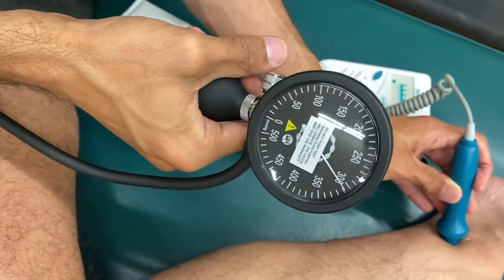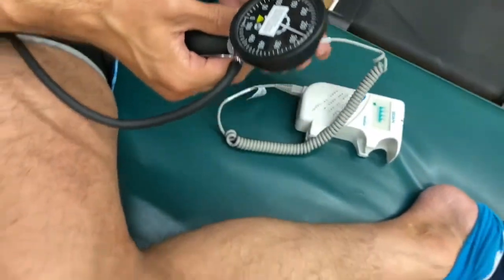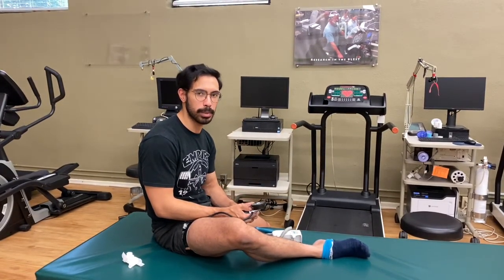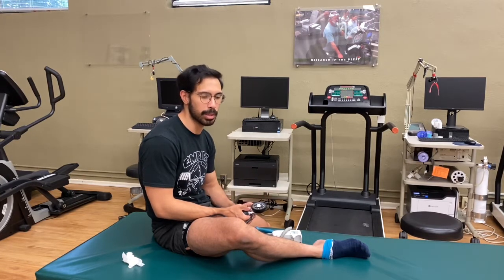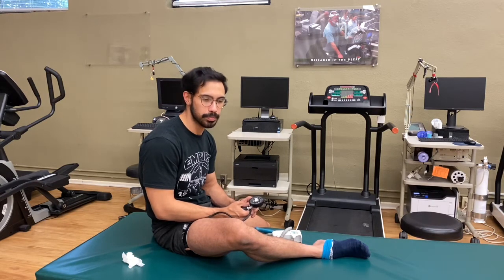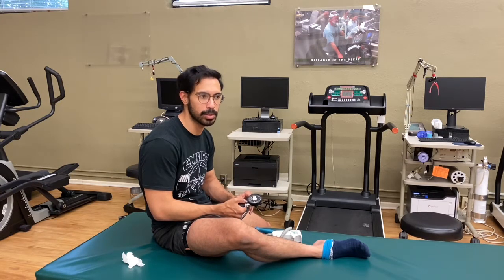So all you have to do is take between 40 and 80% of that number, and that's going to be your working AOP. What I would do is measure that every day when you're training until you get a good idea of the variability between the measurements. And then I would switch to a weekly basis. If you're not very variable there either, I would switch to a monthly basis, but I would preferably do somewhere between once every week to once every 2 weeks, just because if you're actively training, you might get some degree of muscle swelling or edema based on exercise that could affect the amount of pressure that's necessary, because you're changing the width or the diameter of the muscle based on the fluid.